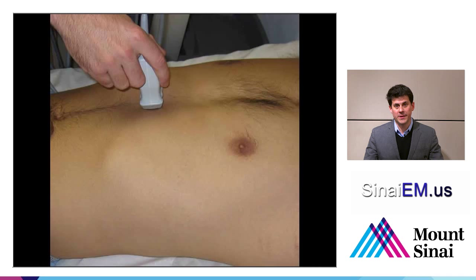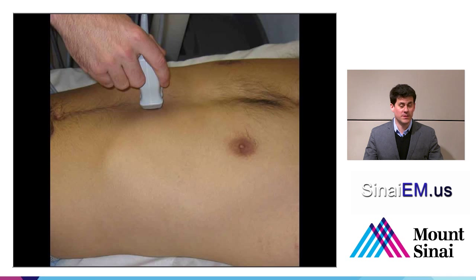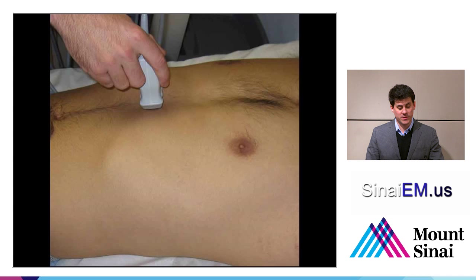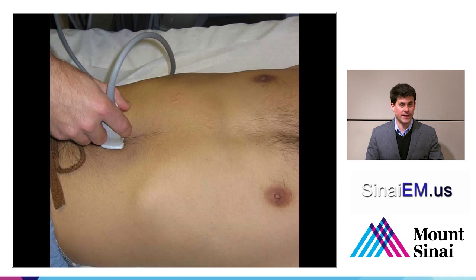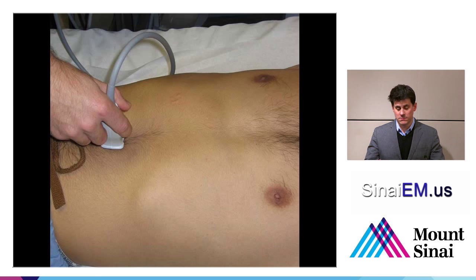Start with the probe in a transverse orientation, beginning just below the xiphoid process in the midline, with the probe marker aimed toward the patient's right-hand side. Scan inferiorly toward the feet, from the sub-xiphoid area down to about the level of the umbilicus. This gives a view from the celiac axis all the way down to the iliac bifurcation.